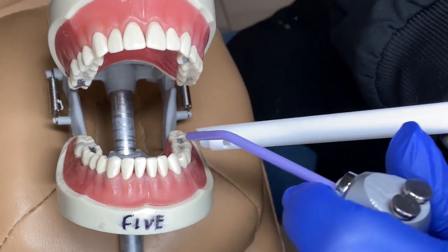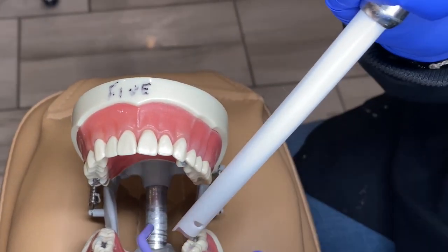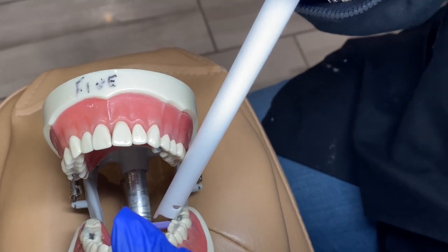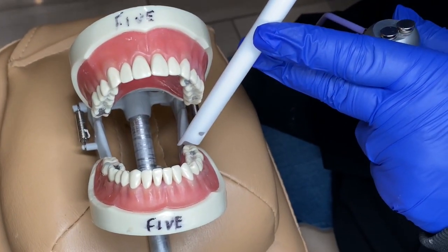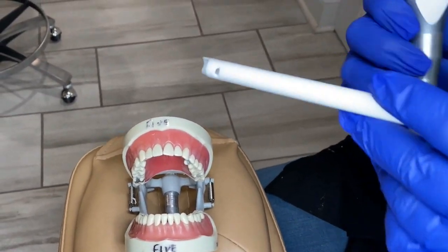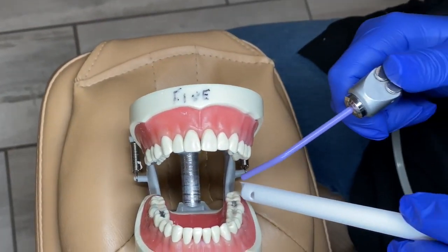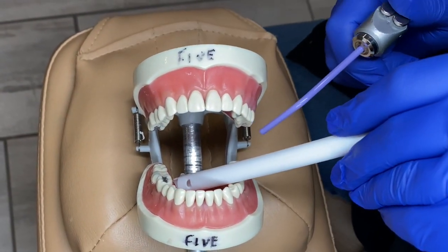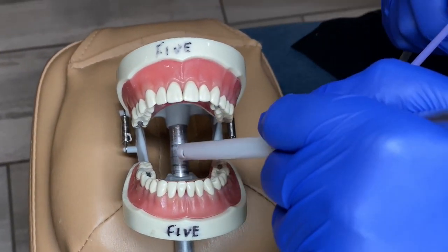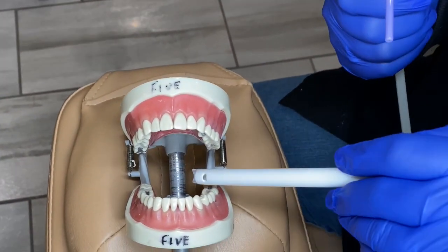If they're on the mesial or the occlusal, you'll be right here to follow. If they're on the lingual, you're going to be right behind them on that occlusal surface to follow that doctor. Your suction only goes into the corners of the vestibule — you want to only suction here and here. You can come down here, but you never want to go directly towards the back of the throat. That will make your patient have that gag reflex, and that won't be very good for anyone.